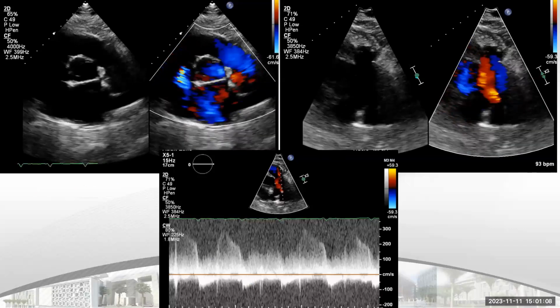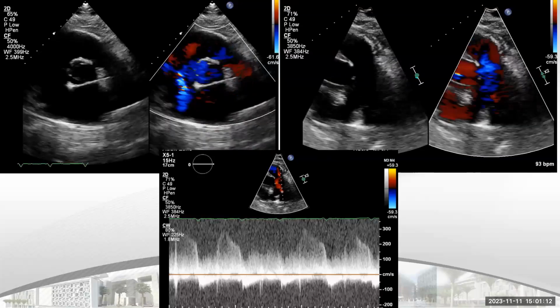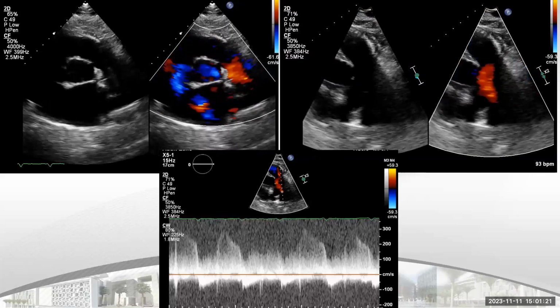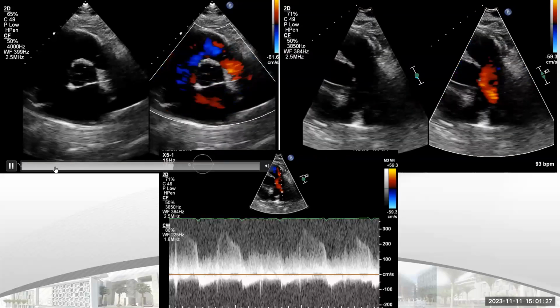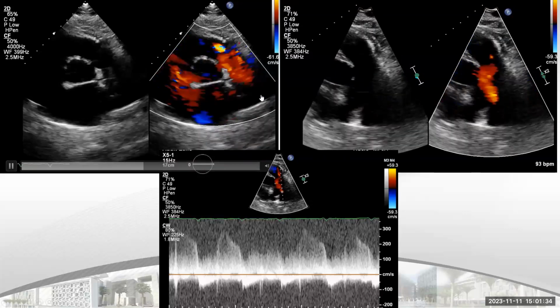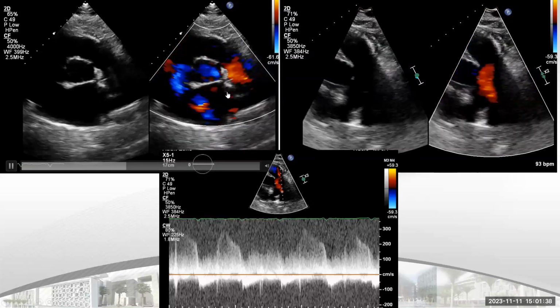Now let's see this. Yeah, this is easy. Please go ahead. Give me one diagnosis only here. PDA, excellent. This is PDA. As you see in short axis, we have some continuous flow acceleration. This color is red. That means there is flow coming from here to here, from this part to this part. And this is short axis.